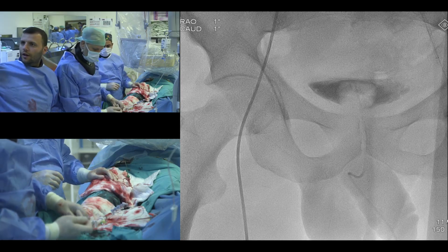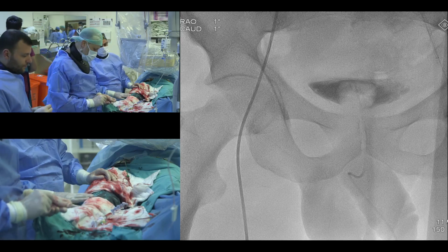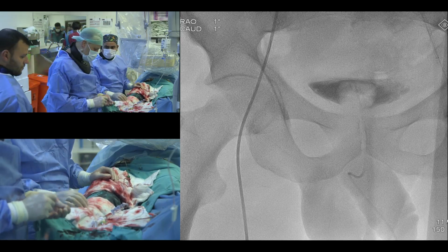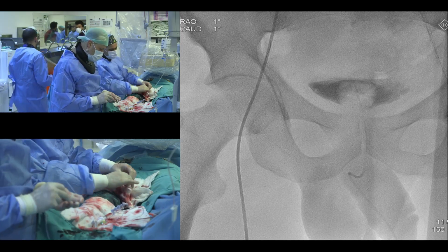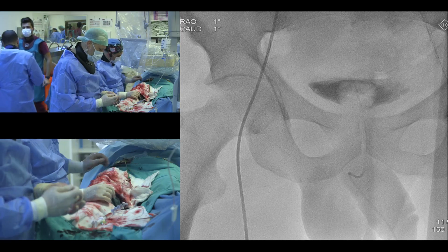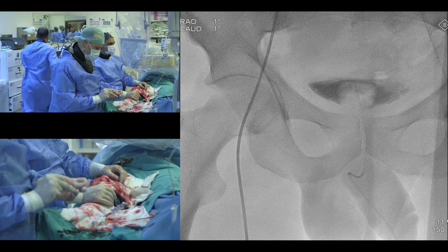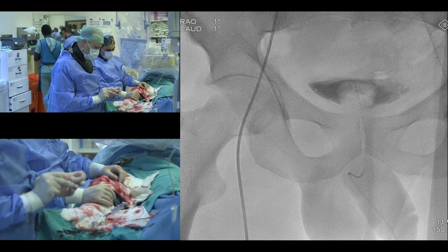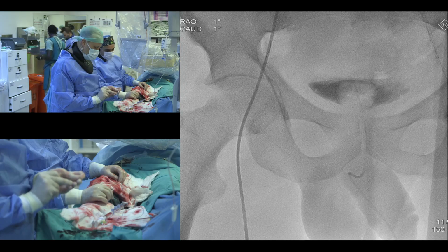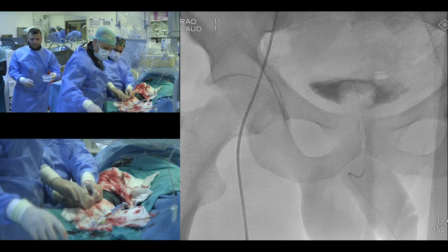Are you with us? Or? Yeah, we are watching you. Okay, we are now advancing the balloon. Which diameter and length? 5 and 115. 150 millimeters. 5 to.